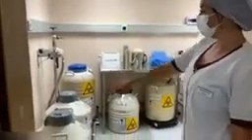The design of the lab is so essential within the clinic. The IVF lab is completely separated, but it is accessible to the OR procedure room via a door or window, and accessible to the andrology lab, which is kept separate also by window. Next to the lab, we have the cryo room, special for the liquid nitrogen tanks. We also have a separate room for the gases, so the gas cylinders: nitrogen, oxygen, and carbon dioxide. The clinic is arranged so that the consult rooms are surrounding it, but each door has an extra lobby so that there's no direct flow from the external clinic into the lab, and it remains at positive pressure inside of the lab.